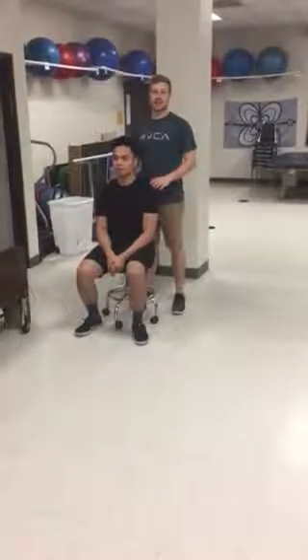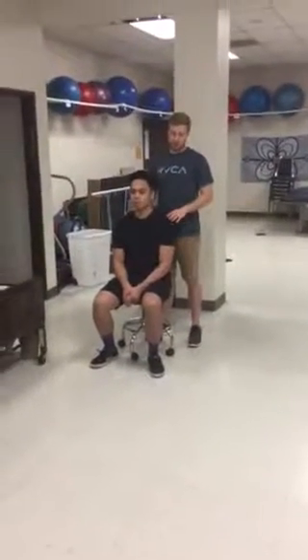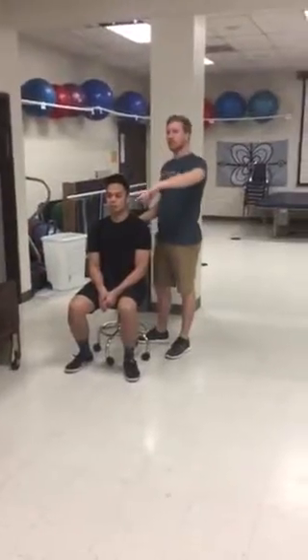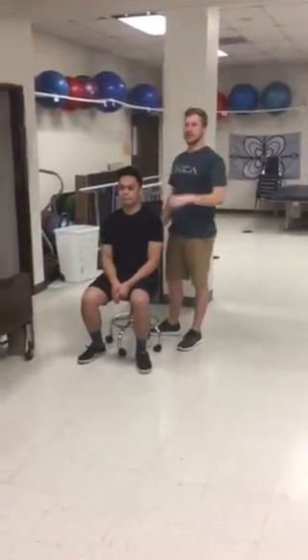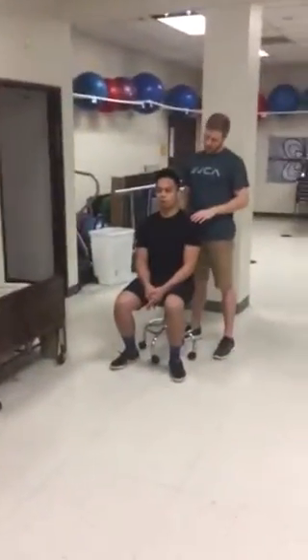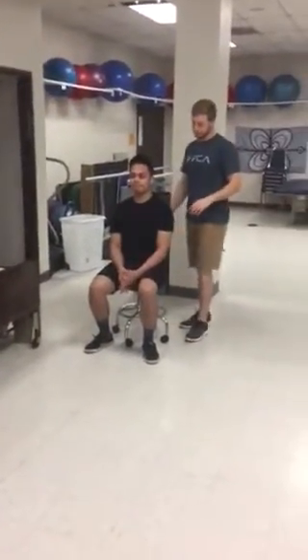So this next test is called the dynamic visual acuity test. What we have set up here is 20 feet away from Christian is a Snellen chart. Christian will be asked what is the smallest line that he is able to read from here.